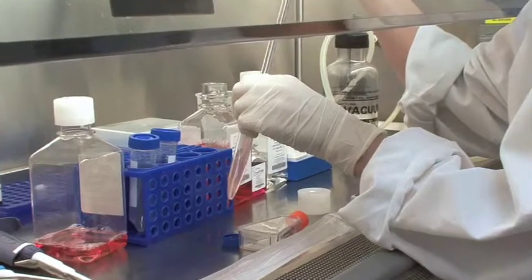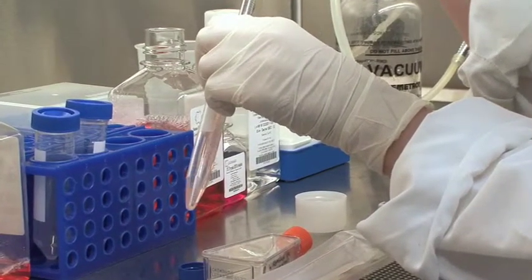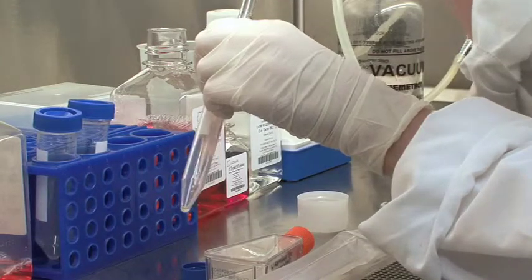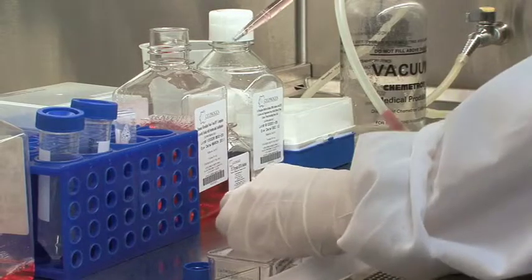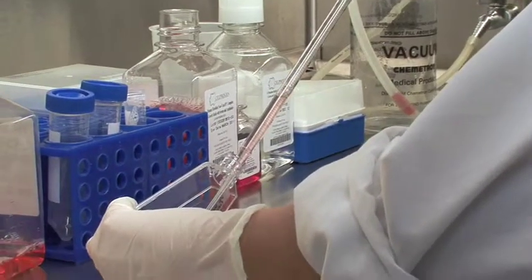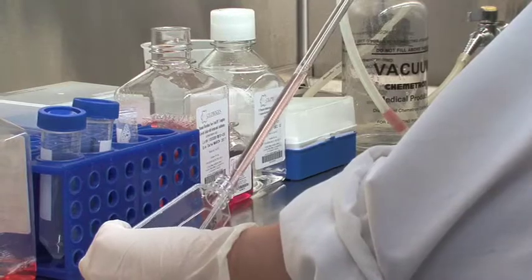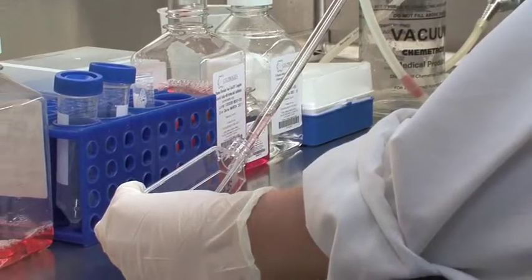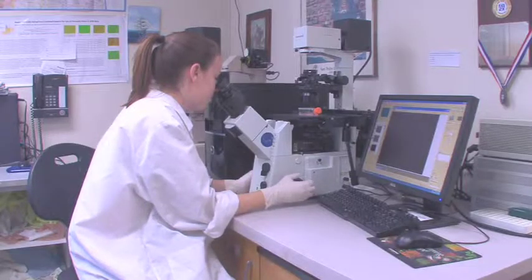Combine all cell pellets in the 50 milliliter tubes into a single 50 milliliter conical tube to reach a total volume of approximately 10.2 milliliters. Note, in the T25 version of the protocol, the total volume will be approximately 7 milliliters. Transfer the reconstituted cells into a pre-coated T75 or T25 flask. Observe the cells under the microscope prior to placing in the incubator.